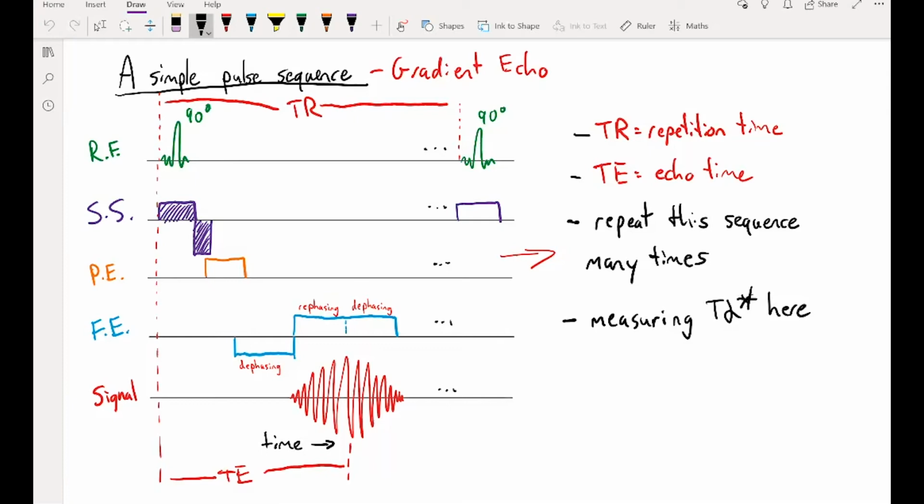This is the first time we've encountered a pulse sequence diagram, and this is essentially showing us how we're using RF pulses, which are our B1 fields, to tip the NMV, and the gradients that we're using to encode spatial information in the X, Y, and Z directions. From left to right represents time, so earlier stuff is happening on the left and later stuff on the right.